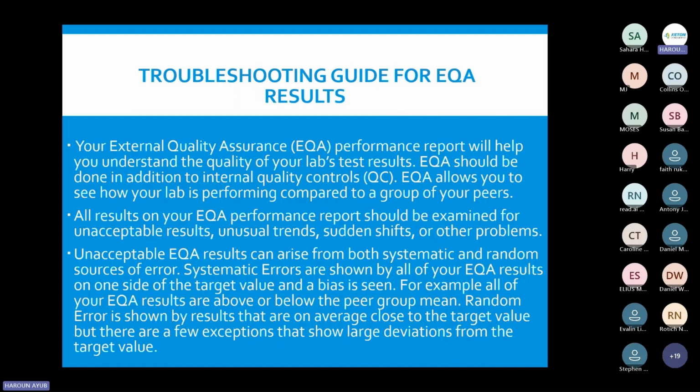So simply, that's how you'll be able to see the failure mode or the interpretation side. EQA should be done in combination with the IQCs. As we discussed the importance of third-party controls and QCs, remember EQA also should be done. The EQA will allow you to see how your lab is performing compared to a group of your peers.